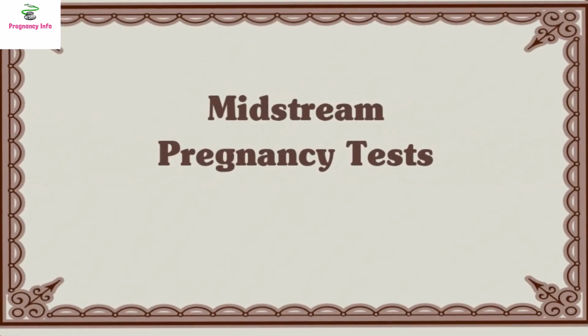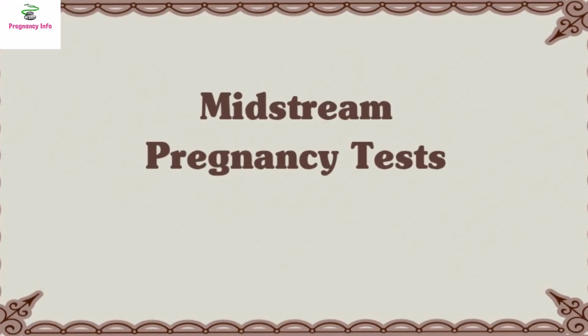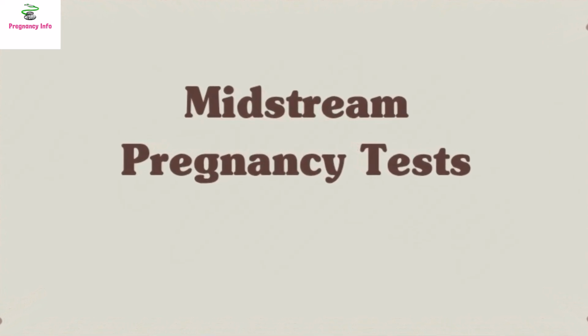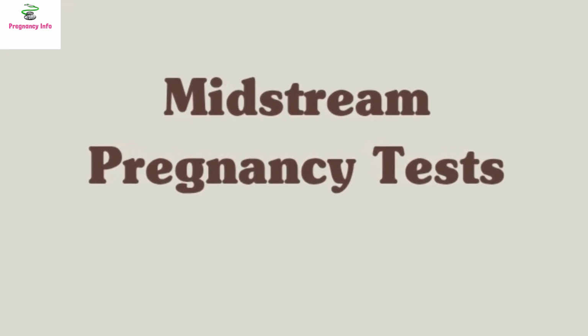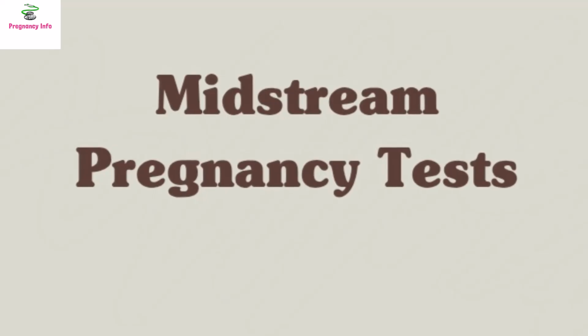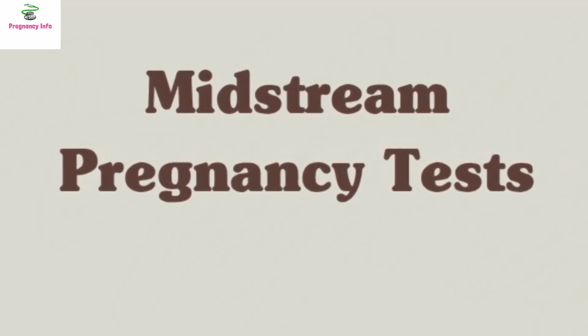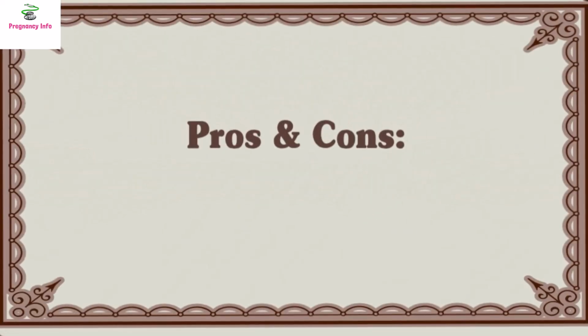Number 2. Midstream pregnancy tests. Examples: Clearblue, First Response, MyLab Midstream. These tests are designed to be placed directly in your urine stream for 5 to 10 seconds. After waiting a few minutes, the result appears as lines, a plus sign, or even a digital display depending on the brand. Pros and cons.